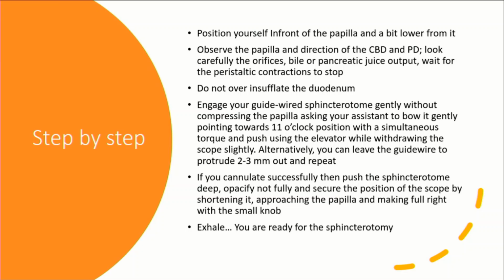We should not over-insufflate the duodenum. When we over-insufflate the duodenum, the papilla structure gets compressed. Then we start engaging the guide wire sphincterotome gently without compressing the papilla, asking your assistant to bend gently towards the 11 o'clock position, while at the same time we apply torque and push with the elevator while withdrawing the scope slightly.